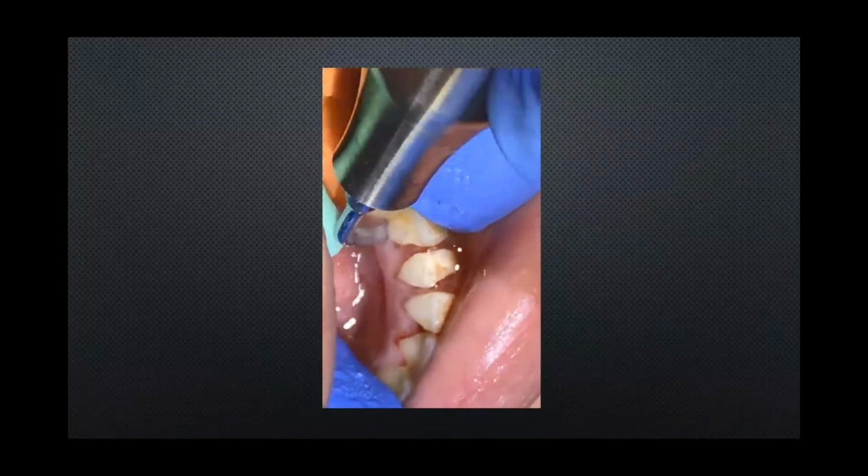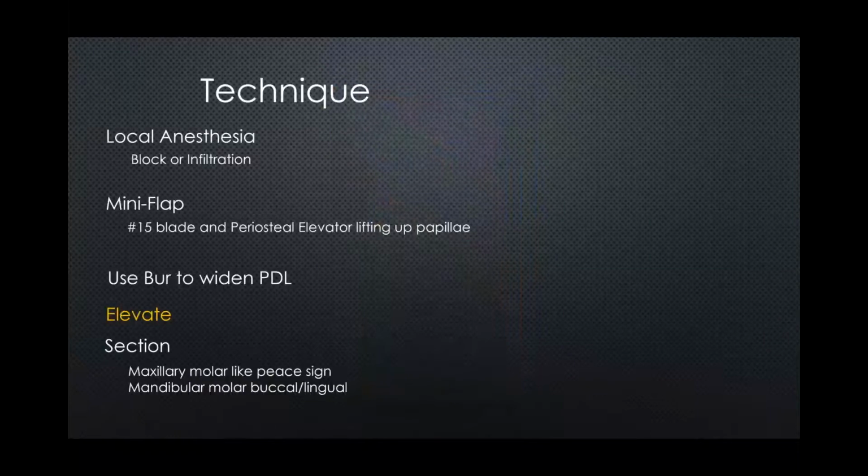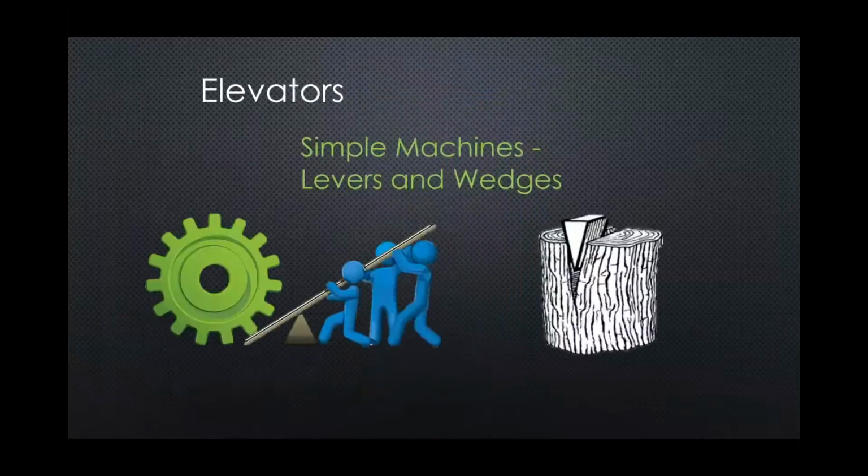And you can see it really loosens up pretty well. Okay. And then we're going to eventually elevate next. Okay, so the principle of elevators all goes back to simple machines. There are levers and wedges, just a simple machine principle.